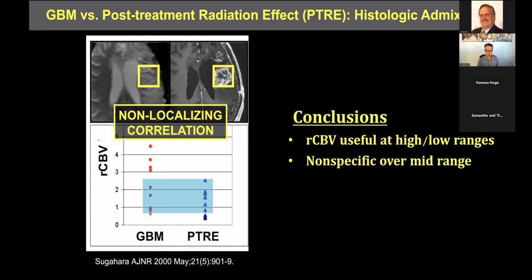And so unfortunately, papers or methods of validation like this have painted a bad reputation of DSC and underrepresented how useful it can be.